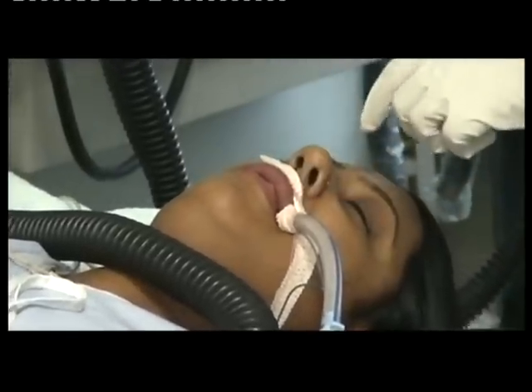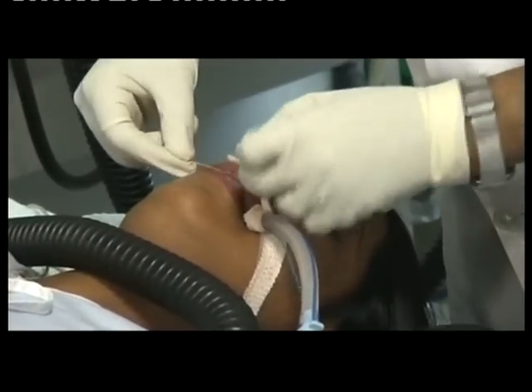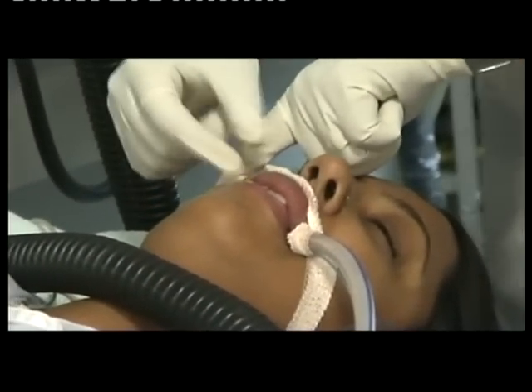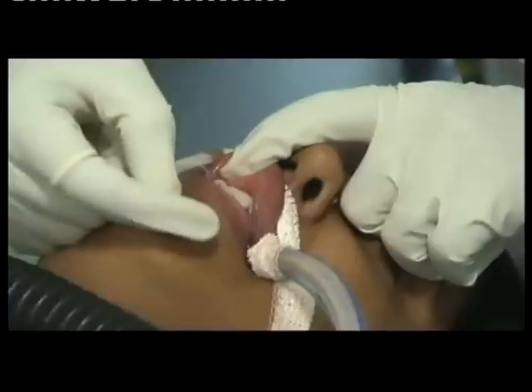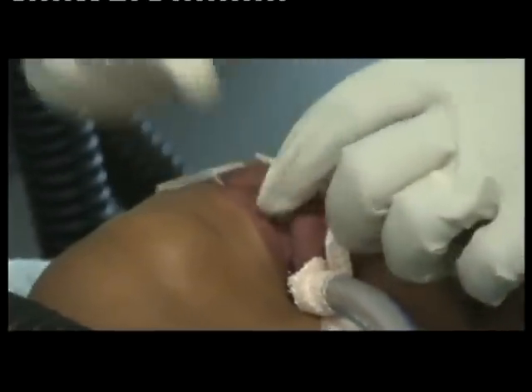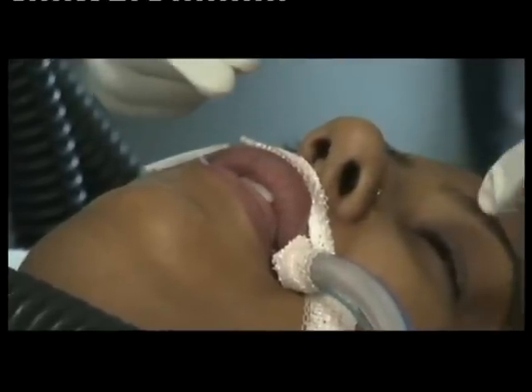If the tooth is loose, we can tie it with the help of a thread so that if it is broken, it is not dislodged. I have tied a tooth and I can fix it with the help of tape here. If the tooth is even dislodged, it will not be lost, swallowed, or aspirated, which adds to the safety. If at all the tooth is damaged, broken, or dislodged, a good oral dental surgeon should be consulted immediately, because if we replace it immediately, the results are good.